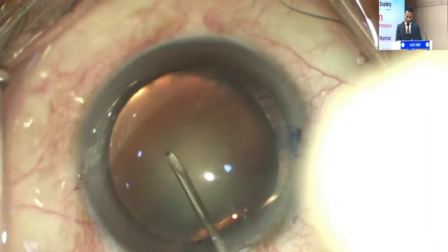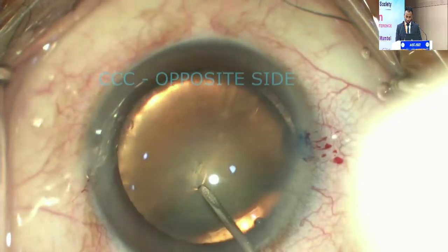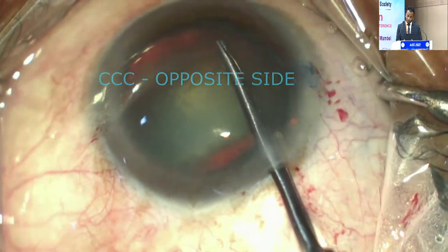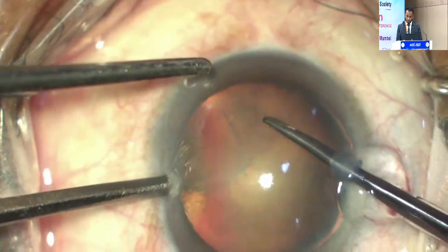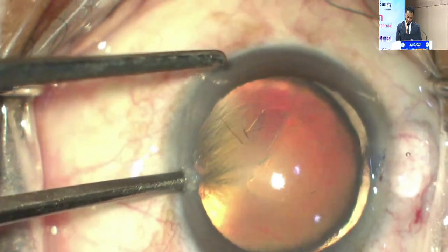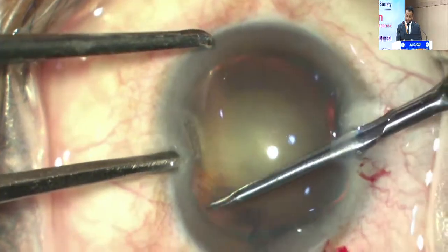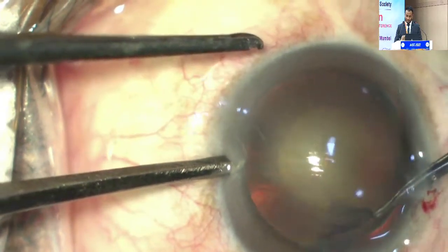You could see that the zonular dialysis is almost around 5 clock hours. So I've started the CCC in the opposite direction. Using forceps gives a more stable approach. Some people also use hooks during the extension of the rhexis so that it stabilizes the bag more.